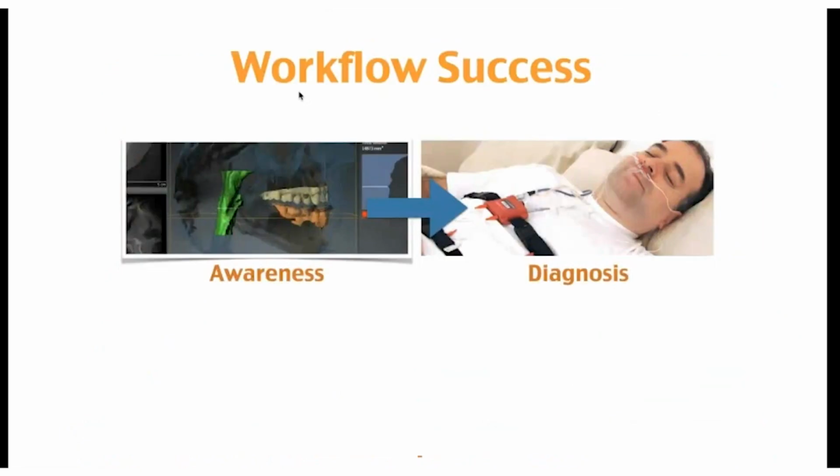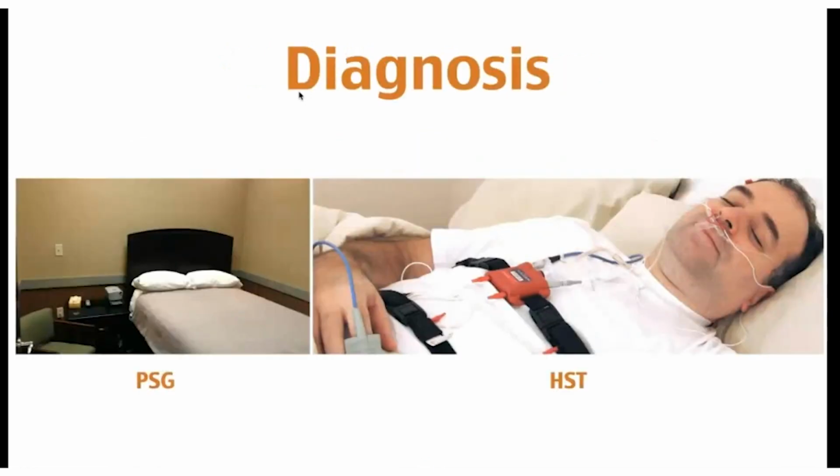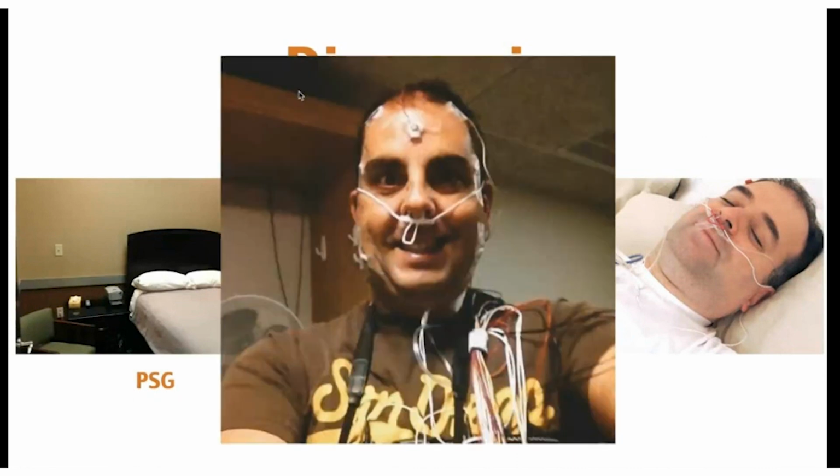More and more, especially since COVID, home sleep tests are being utilized. A lot of patients think they have to go spend the night somewhere strange with people watching them, but home sleep tests are used more and more. In the hospital or in the lab, it's called a PSG. HST is a home sleep test. This is what the in-lab studies look like. A lot of people say, no way will I ever sleep with all these wires and channels.